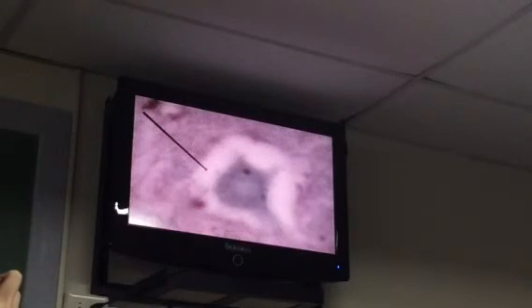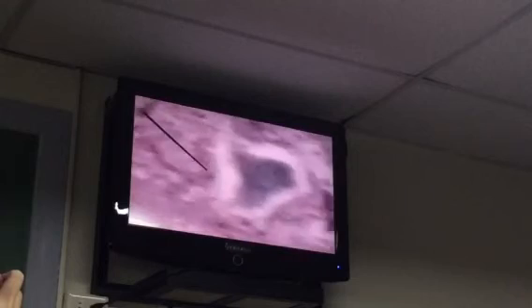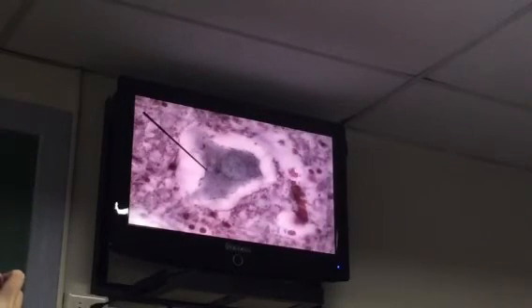So you can see again a nucleus. Tingnan natin kung mas maganda nucleus. Here's this one.